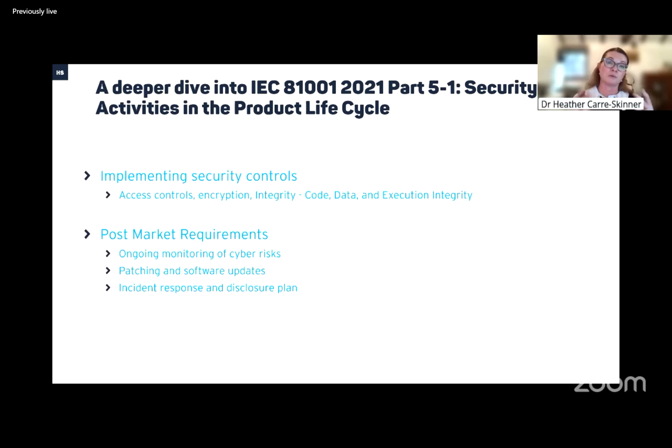So as we all know, with the bolstering of all the MDR requirements now, anything you do with a medical device has to be ongoing. So this is ongoing monitoring of cyber risks. We're not just thinking about attacks that have happened to customers or potential customers and clients. This is very proactive in that you're looking at databases which can inform about recent attacks.